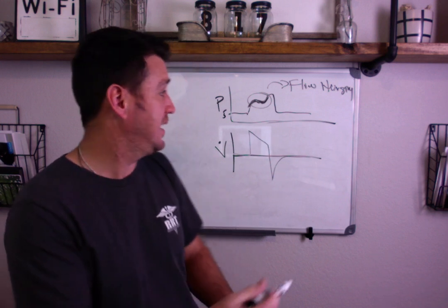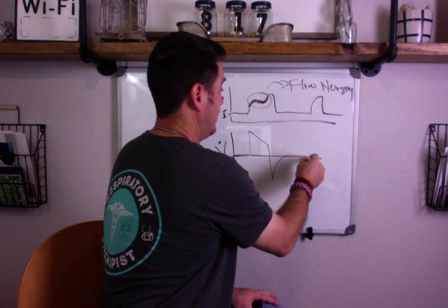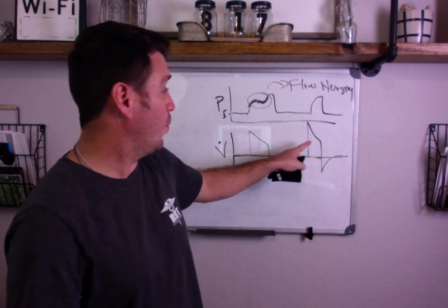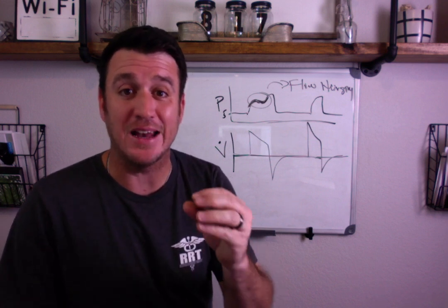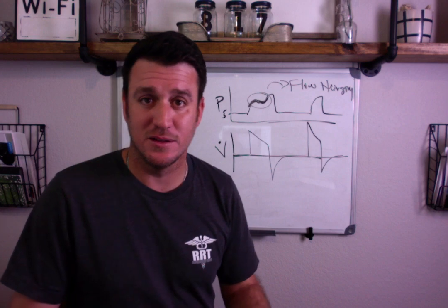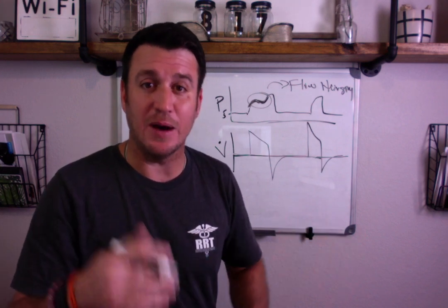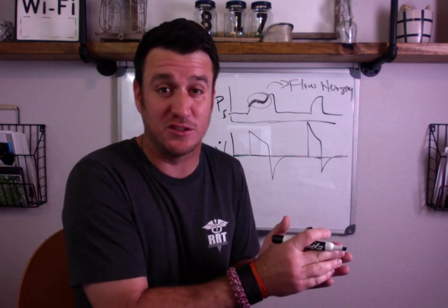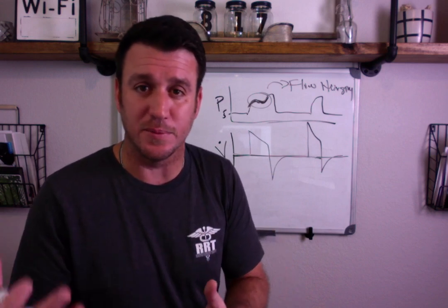And when we did, on the next breath, we saw this. Okay? So we went way up on the flow, but this is what we finally got. We finally met the patient's inspiratory flow demands. Okay, now we settled it, we left it there. Now what you're thinking here is, didn't your pressures increase dramatically because you went from 60 liters per minute up to 145 liters per minute?